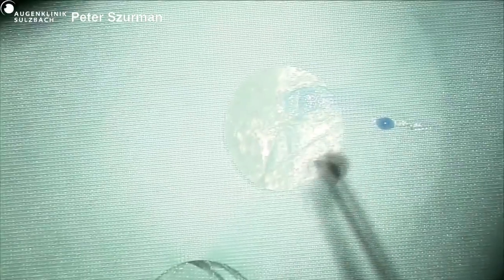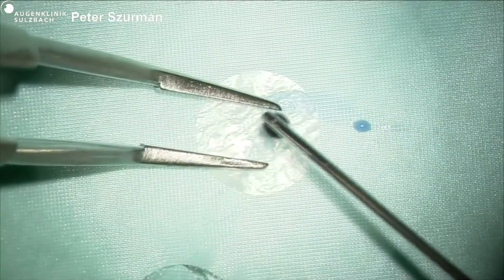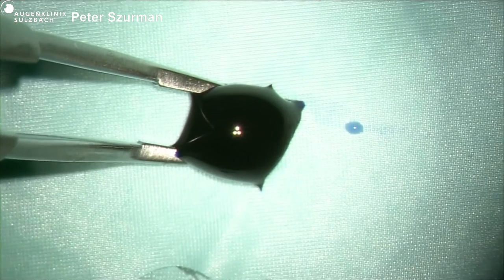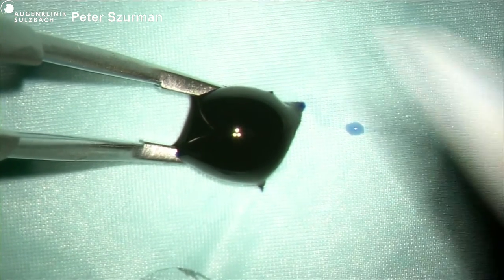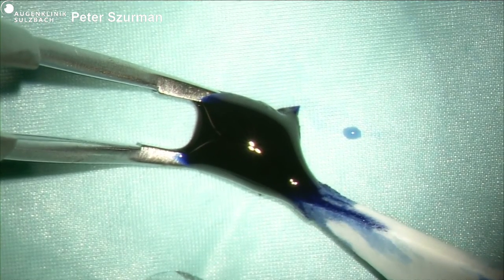Peter's question. So he's confronting now a smooth retina, an irregular break right in the macula, and he's selecting a surface amniotic membrane patch. So, Grazia, pretend you had never seen him describing that he's going to put amniotic membrane on the retina. What would your approach have been?